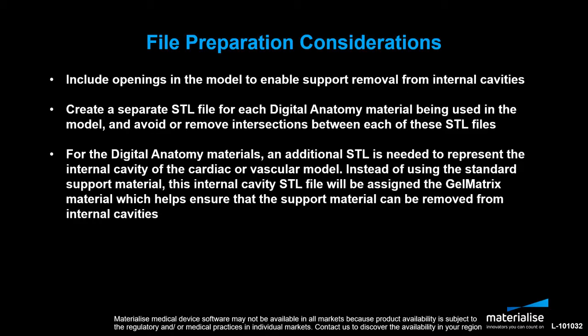Next, create a separate STL file for each digital anatomy material being used in the model and avoid or remove intersections between each of these STL files.